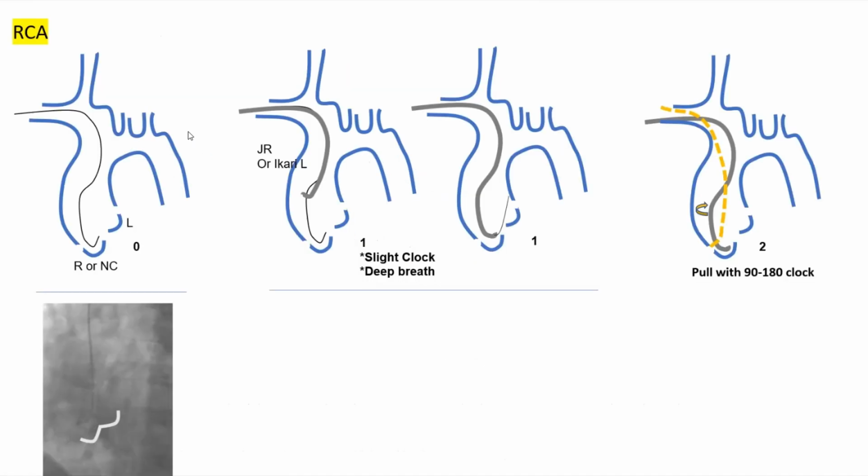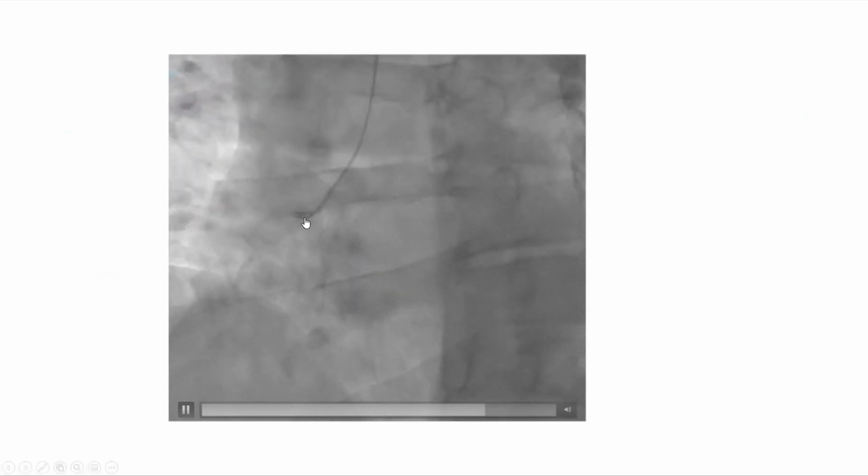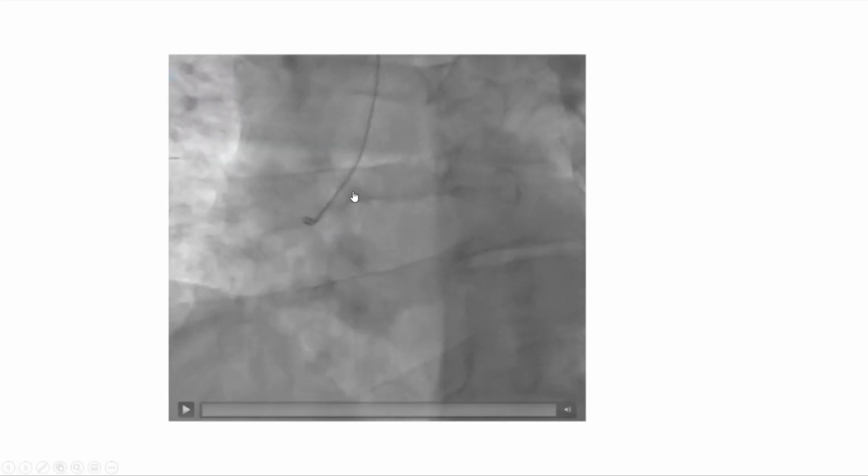The way you engage Ikari Left for the right coronary artery is similar to the Judkins right. You go with your catheter over the wire all the way to the right cusp, which is the lower cusp compared to the left cusp. This is the right cusp. Then you pull with a clockwise torque, 90 to 180 degree clockwise torque. This is an illustration of that. So here we are on the right cusp and we pulled with a clockwise torque. Very easy engagement. Then from that, you can push it to create the Amplatz Left power position, or you pull it to keep the JR4 position.